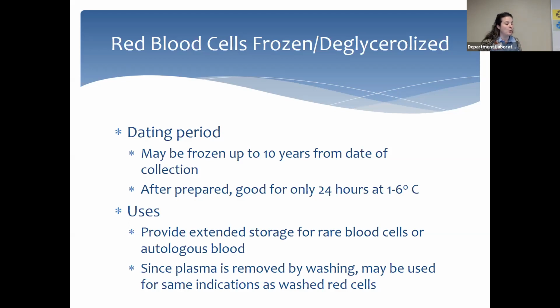Some examples of when you want to use frozen red cells: if a patient has a very rare antibody to maybe a public antigen, okay? So not very many people are antigen negative, okay? They could freeze their blood. Maybe not so much little e, more Lutheran B, maybe a Diego, Chido Rogers, some that you haven't even heard of. Those would be ones that people would freeze. If you're Bombay, okay, probably definitely want to keep frozen stock.